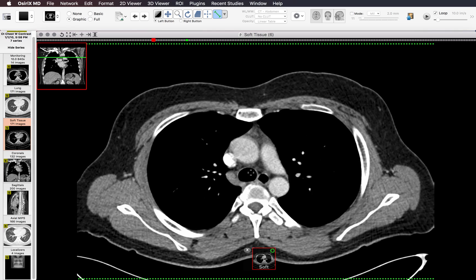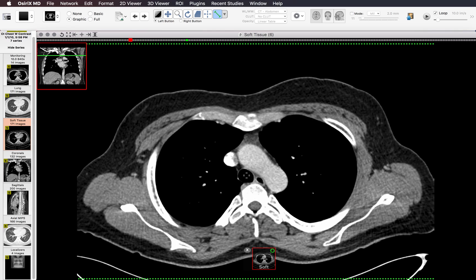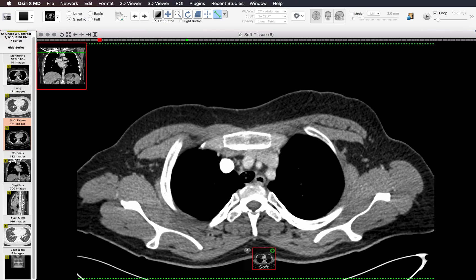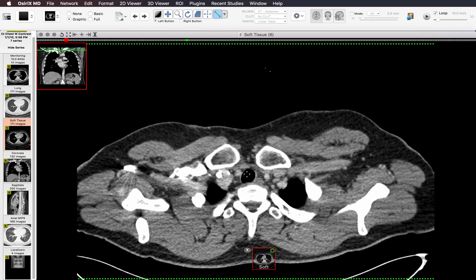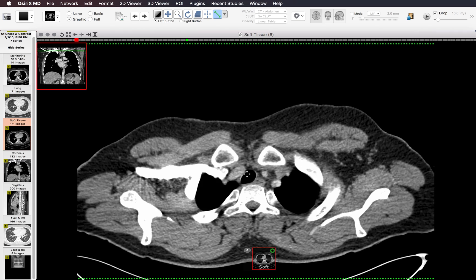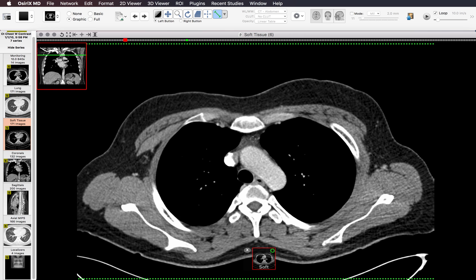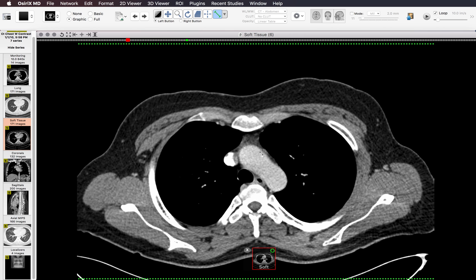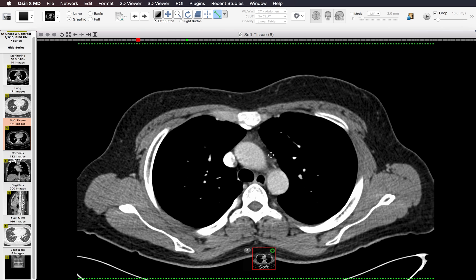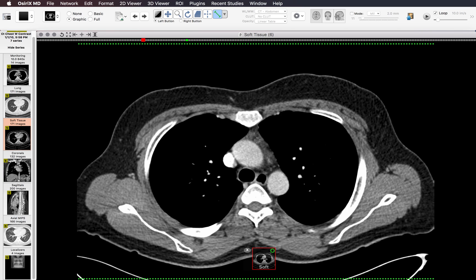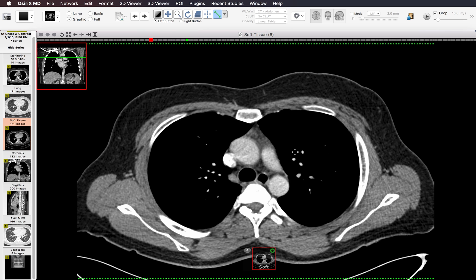Then I continue up looking at the paratracheal region and the esophagus for enlarged lymph nodes, up until I get to the thoracic inlet. Then I go back down looking at the anterior mediastinum. Here I have some normal thymic tissue — I know it's normal because it's soft tissue interspersed with little bits of fat, meaning this is normal benign thymus and not a thymic mass or a lymph node.